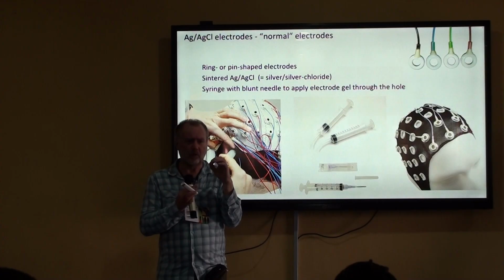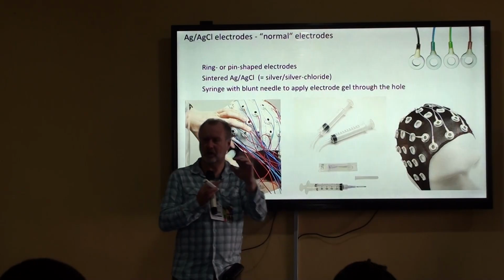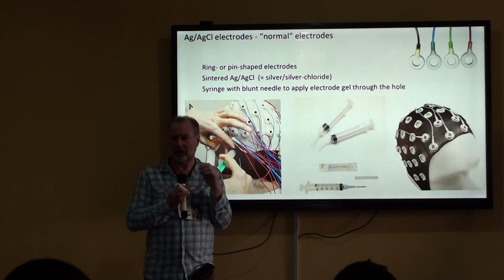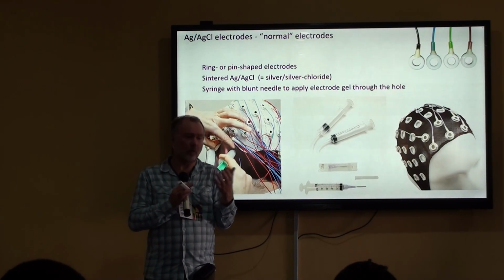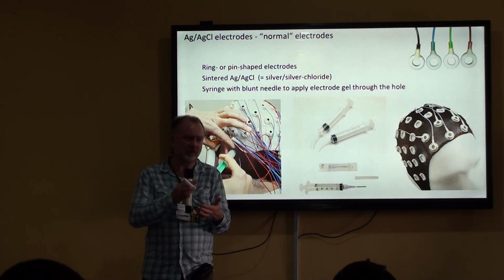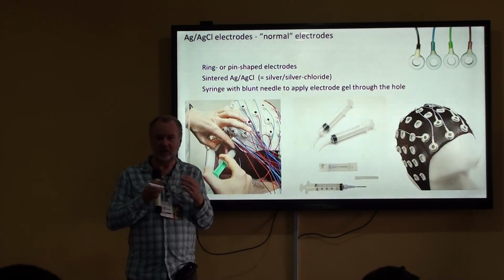If the hole is very small, so if you cannot fit a Q-tip through, well, we have blunt needles, but the blunt needles still allow you to scratch a little bit. So that is something where you really have to develop your skills and ask your participants what they feel. So I always first show them the needle is really blunt, by poking myself, so I'm not going to puncture you. Actually, with children, we try to avoid them seeing the needle.